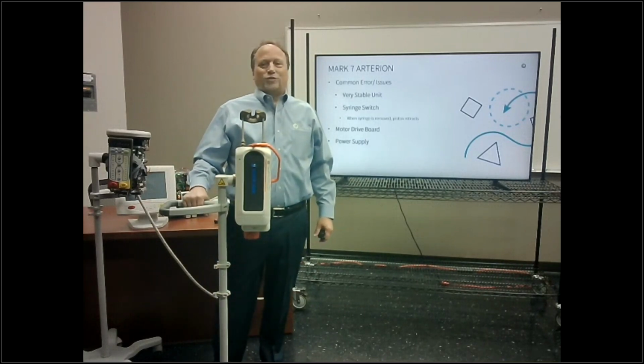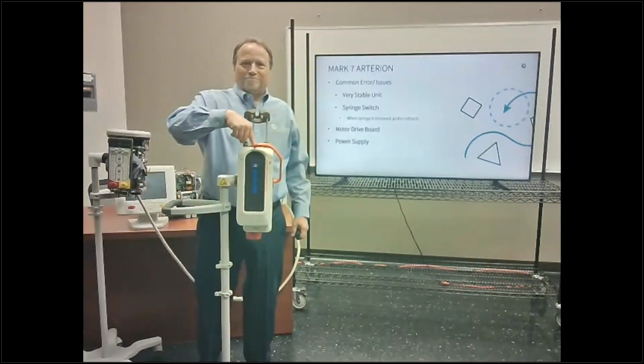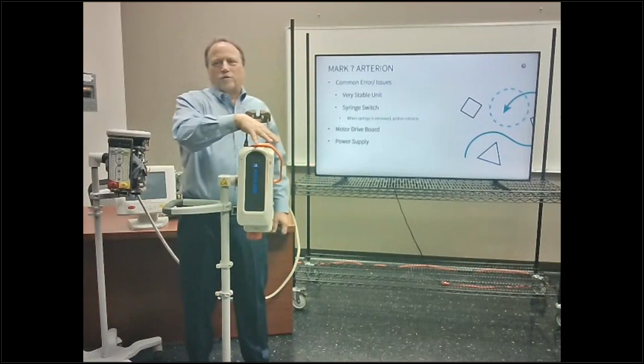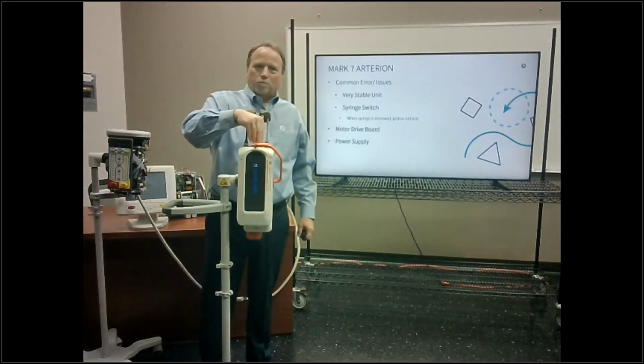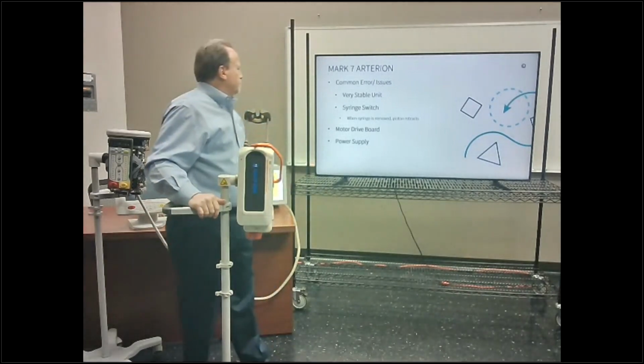Huh. Do you have a syringe in it? No, we took the syringe out and my piston doesn't retract. It's not the switch, it's glued down there. Nice hot towels in there, we'll clean that right up. Don't pour water in it. Just a warm, moist towel will clean all that contrast off and it'll pop up.